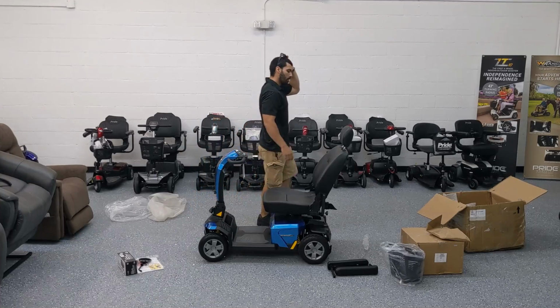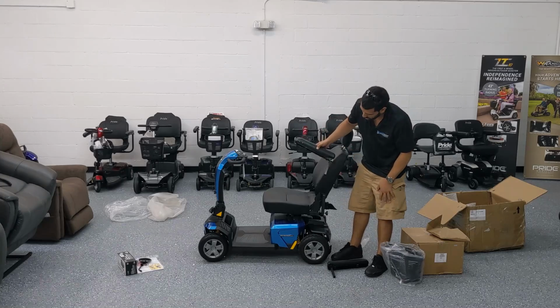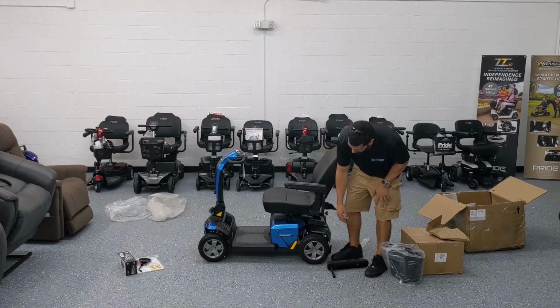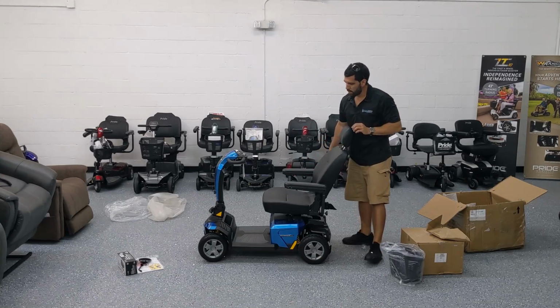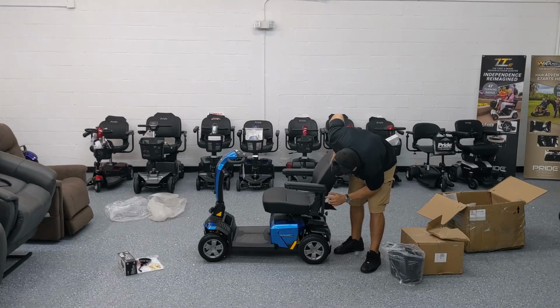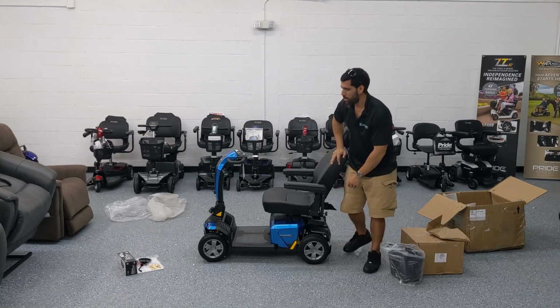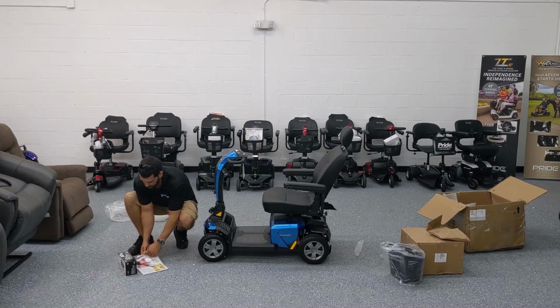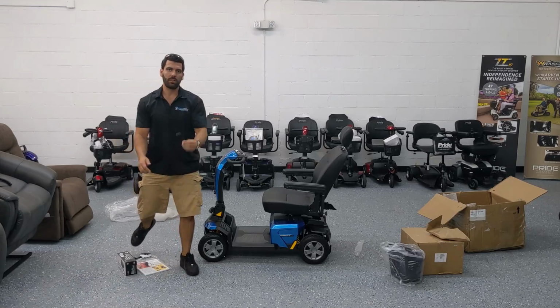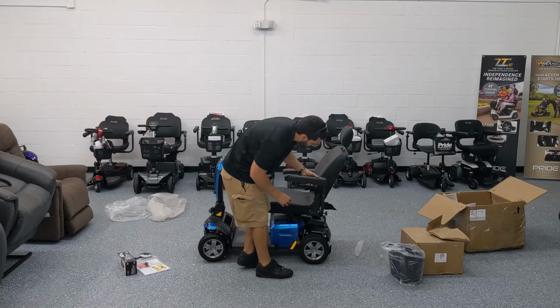So, for the armrests, once you have the elbows in, you just drop them right into the receiver. Now there is an Allen key provided to tighten these little, basically it's like a little tension screw. And inside of your user manual bag that the keys come in, you're going to find not only the keys but this Allen wrench, which is the perfect fit for the armrest.